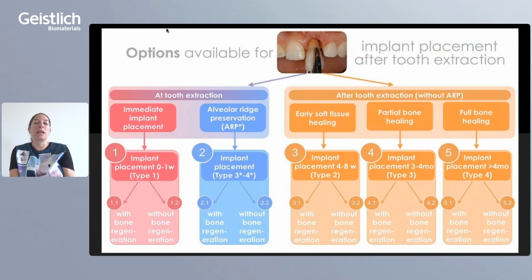So again, I would like to look at this scheme with you, the options that we have for implant placement.